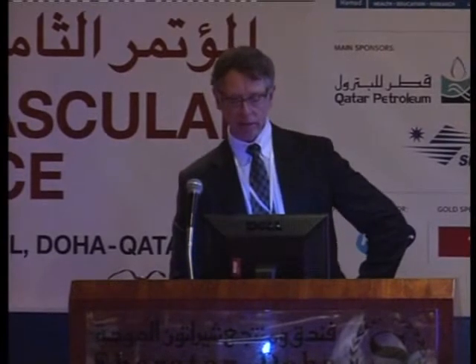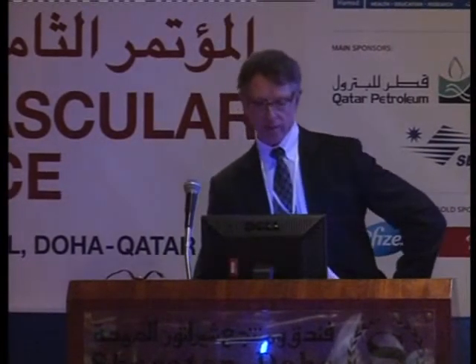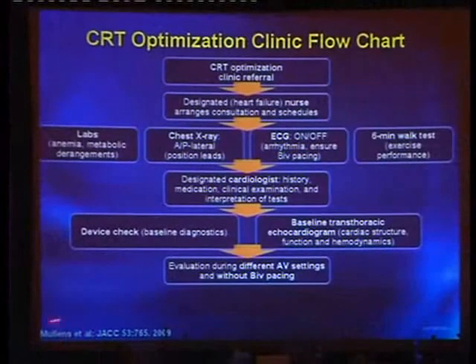But 2 things I'd like to talk about briefly first is that if you have not looked at this article from Mullins, this is from the Cleveland Clinic, Bruce Wilkoff is the senior author. The citation was in JACC last year, on their CRT optimization clinic. This is really an excellent article.